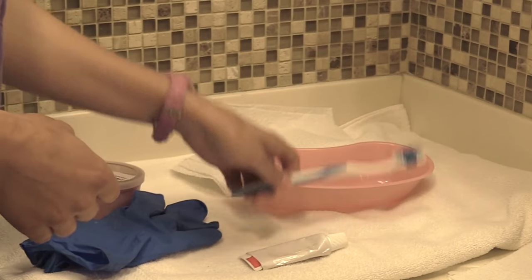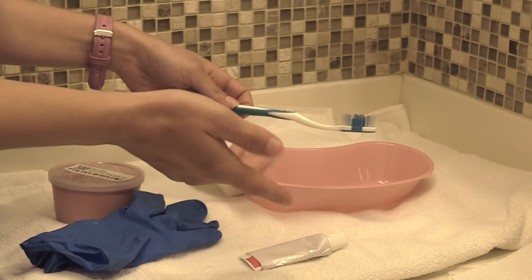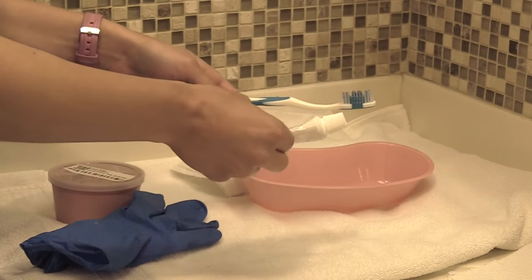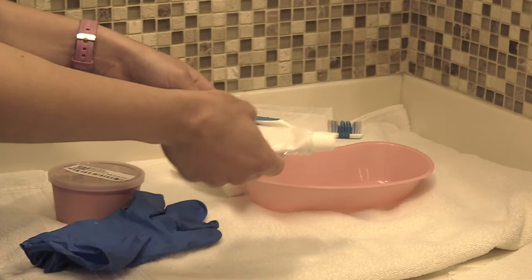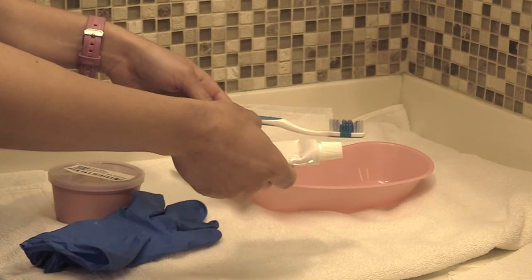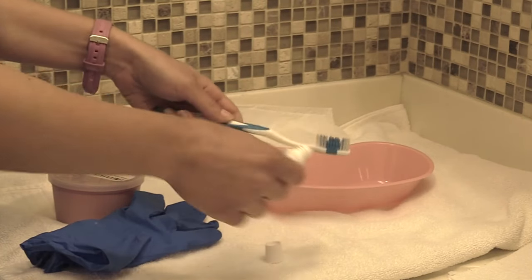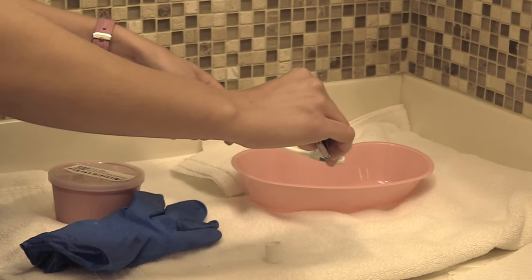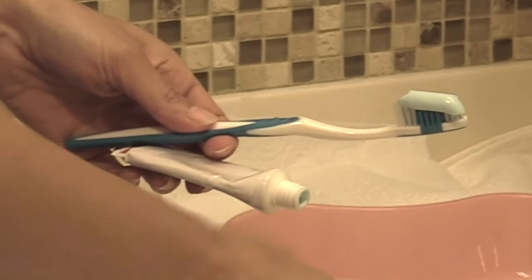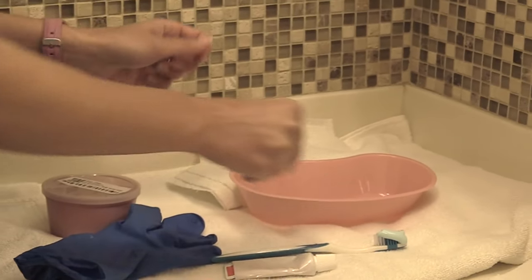Now we're going to prep our toothbrush. You want to use a soft bristle toothbrush, or check with your patient and supplies to see if you have a denture cleaning brush, which is specifically made for cleaning dentures. We're going to use some cleaning paste. I know a lot of hospitals may only have regular toothpaste — you can use that, but just keep in mind regular toothpaste can be abrasive to the dentures if it has whiteners in it. So we're going to use cleaning paste and put it on our toothbrush just like you normally would at home, then put the cap back on.